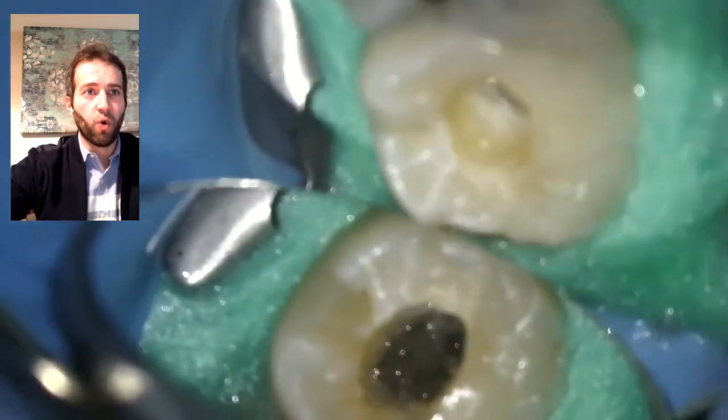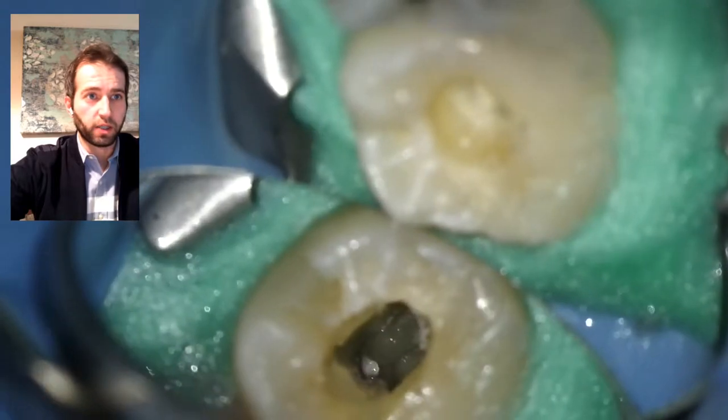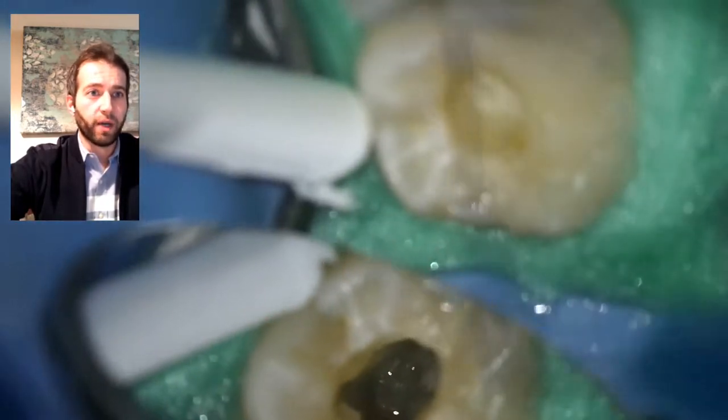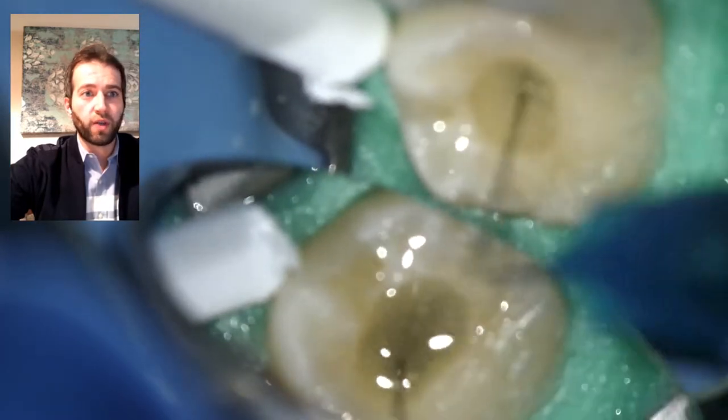Then you just take your sponge out in one pull instead of getting it shredded into pieces. This is another good indication — looking at the calcium hydroxide. The calcium hydroxide was nice and white, which tells you that there's no drainage.